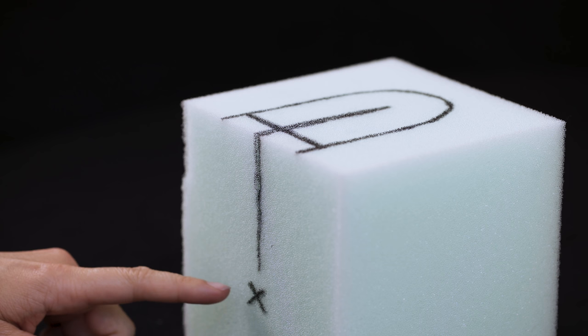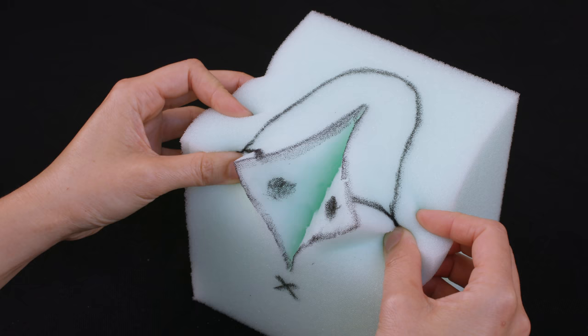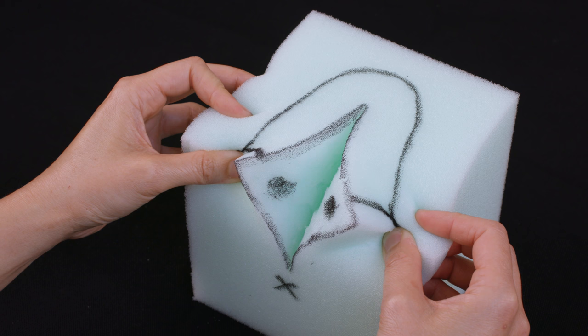I've cut a cleft into the block to recreate a second degree tear. The black mark inside represents the torn edges of the bulbocavernosis muscle.